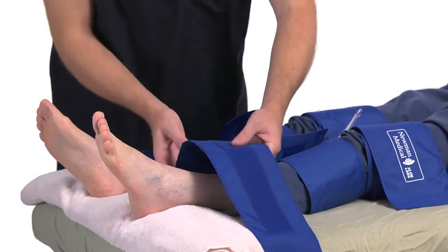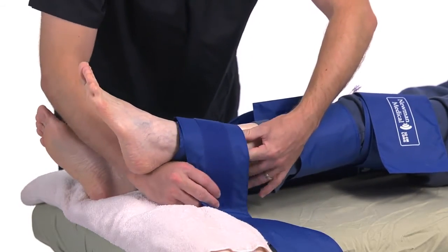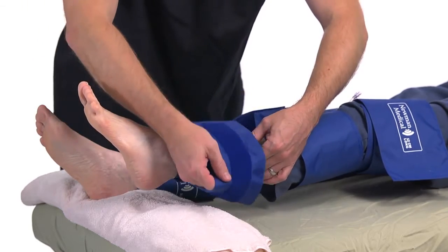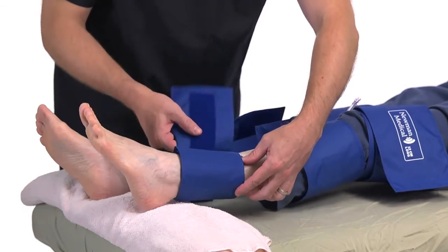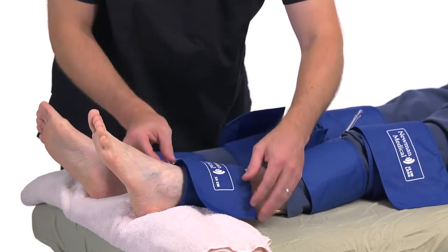Now, at the ankle, again start by wrapping the bladder portion first. Place the cuff under the ankle and wrap it around the ankle, holding it in place with one hand while wrapping it with the other. Try to wrap it straight. You can rotate it around to get the hose out of the way of the artery.